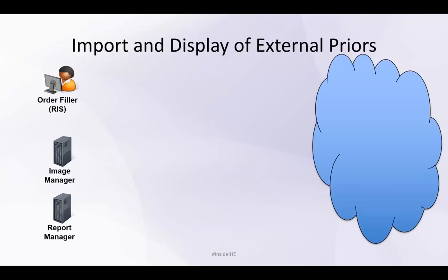At the high level, the IHE Profile has, on the left, the local site, and on the right, the set of remote facilities that are part of the IDEP sharing arrangement, and the importer in the middle. The trigger for the workflow is a conventional procedure scheduled message, which is sent to the importer.